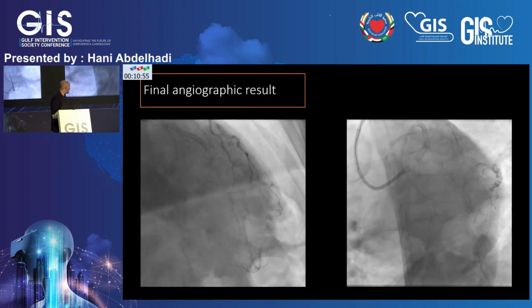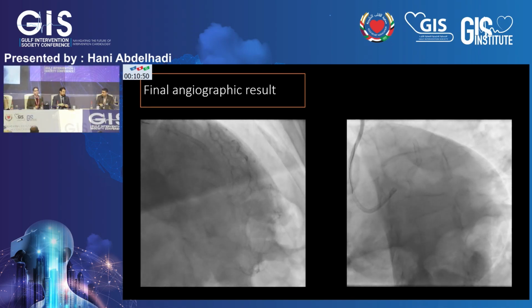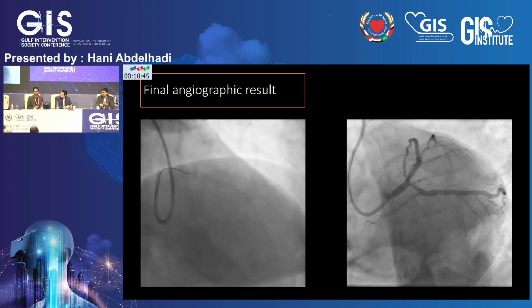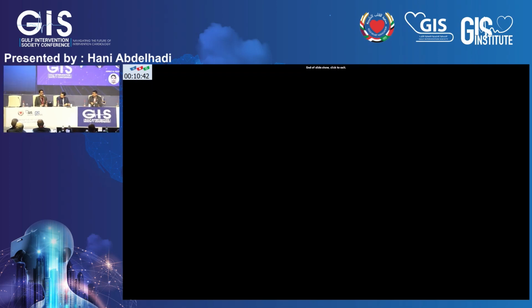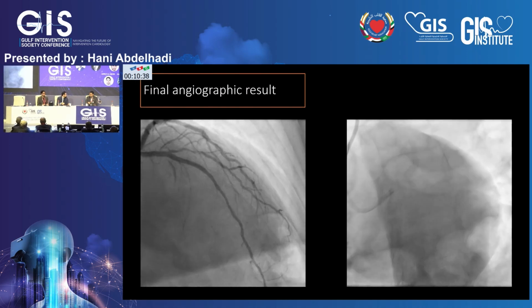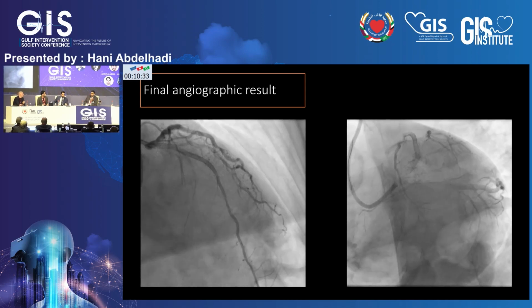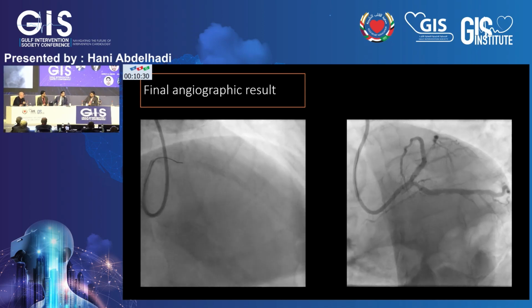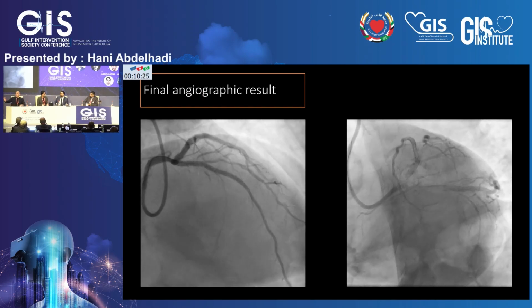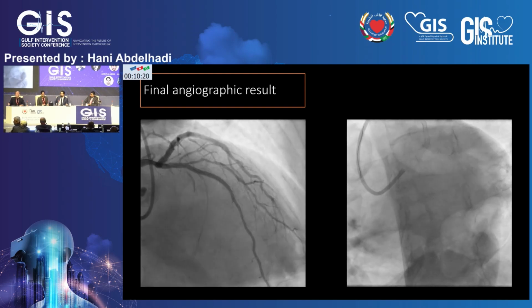And I think this is an unanswered question in interventional cardiology, and is the topic of a lot of discussion about the use of a drug-eluting balloon for side branches, which may be of additive benefit in terms of a provisional approach. I will ask Dr. Ziad Ali at this point, since DCB is coming and imaging is evolving, how much dissection, how much of the lesion are you happy to leave at the end of the case when you do a DCB and not stent that lesion, especially for ostial lesions?